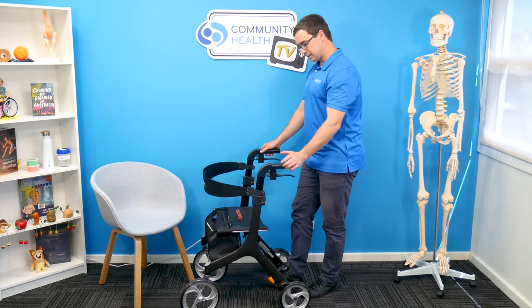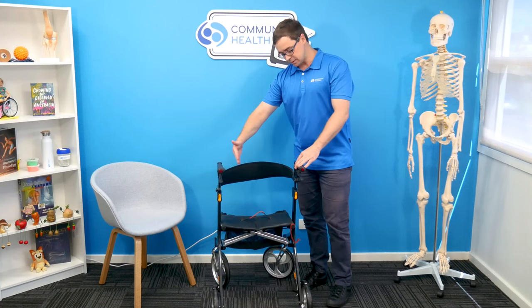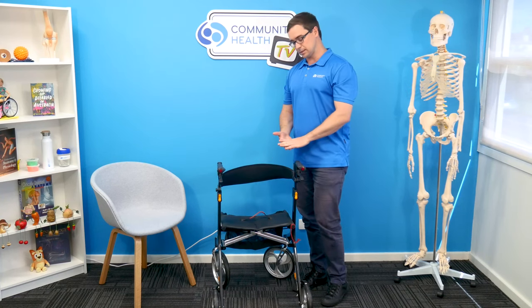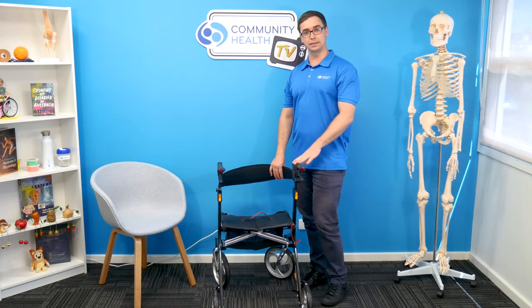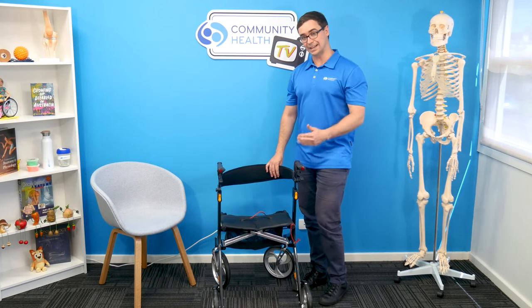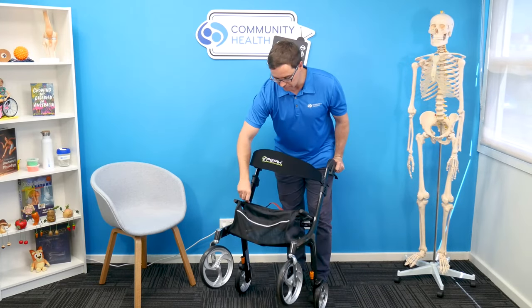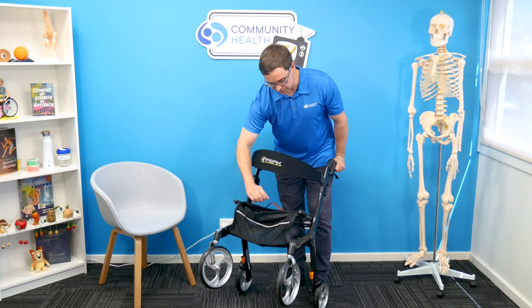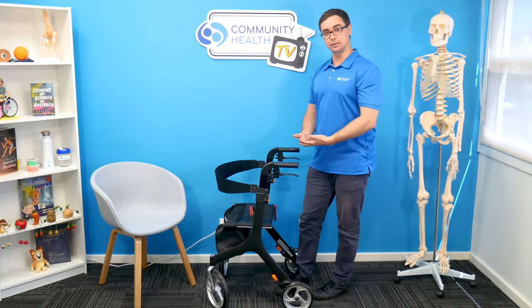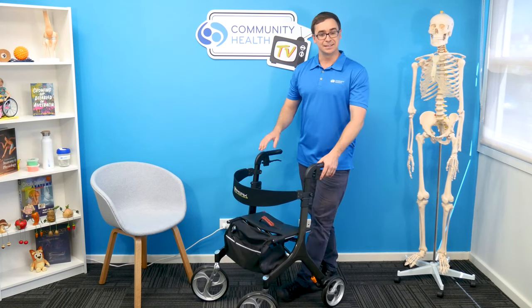What else do we think about? The ability to sit on the walker — that could be by body dimensions, but also weight. This model has a safe weight limit of 120 kilos. We like to see people being within 10% of that range, so we would prefer people to be around 110 kilos or less to be confident. Most walkers will have the ability to store things, so there may be additional weight sitting in the walker, or the person sitting down may be carrying something as well. So for extra safety, to operate within those safe weight limits, we like to see somebody sitting under that.